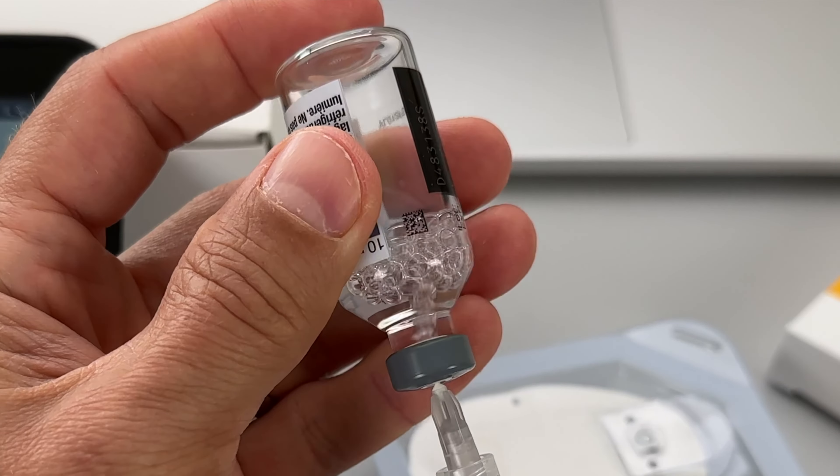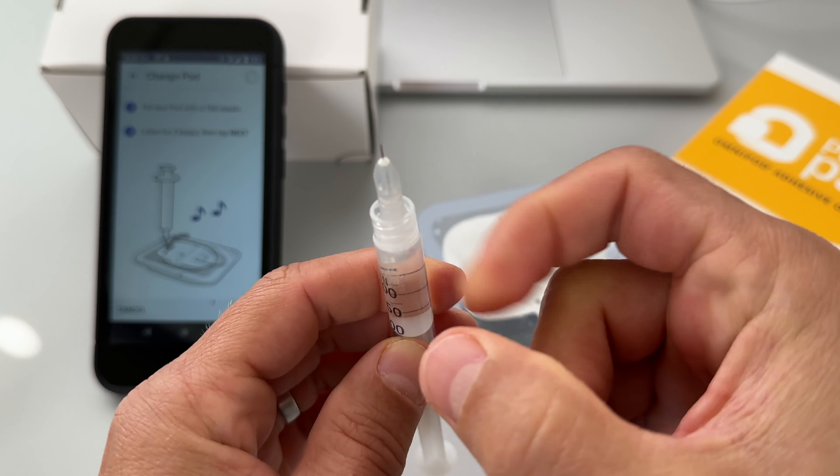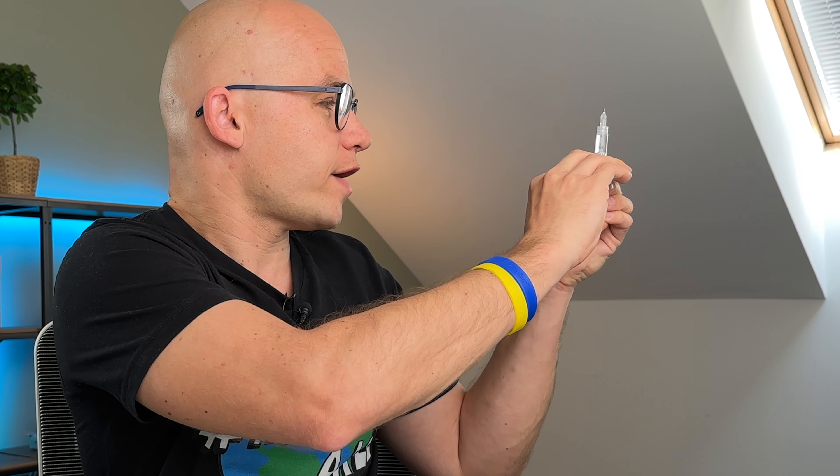Before you start your first pod, you need to create your basal profile. You also need to set your target glucose, insulin-to-carb ratio, correction factors, duration of insulin action, and a couple more things. You can see what parameters I'm entering on the screen, but you should always set the parameters provided by your healthcare provider based on your individual needs. The system finally wants me to set up a new pod.